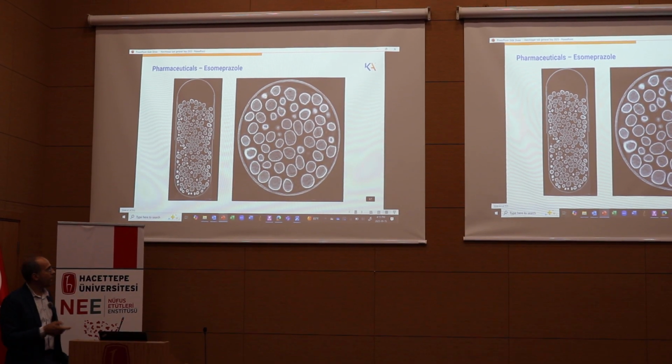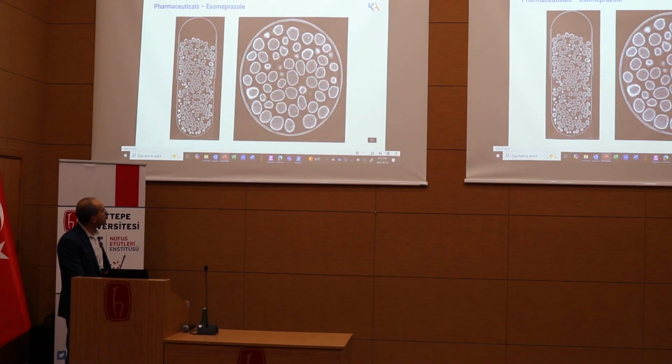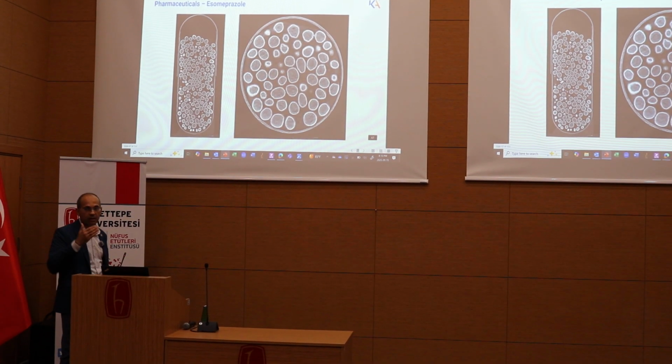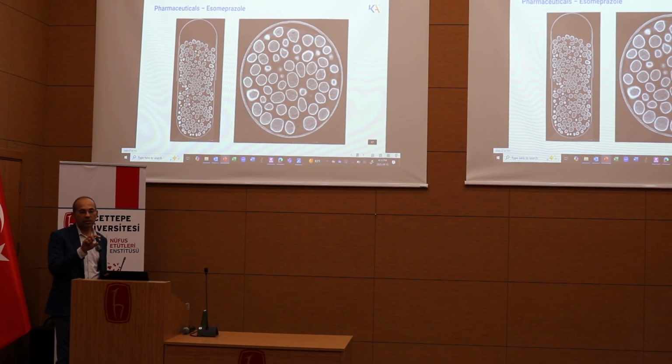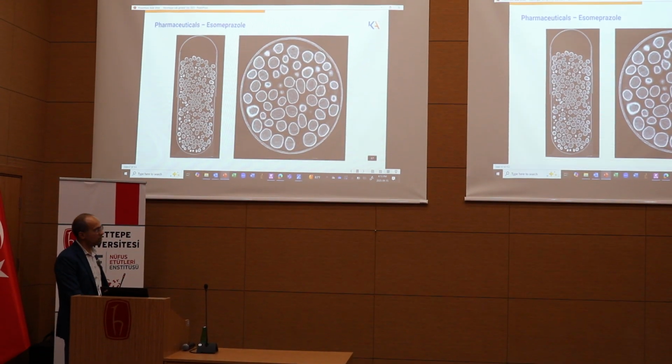It's a PPI. And so the way they do time-released capsules is inside each of these capsules, they put in these little particles, and the particles have a coating. Actually, they have multiple coatings on them. So this can be used to resolve that coating to see how good it is, and if you want to have a certain distribution of coating.